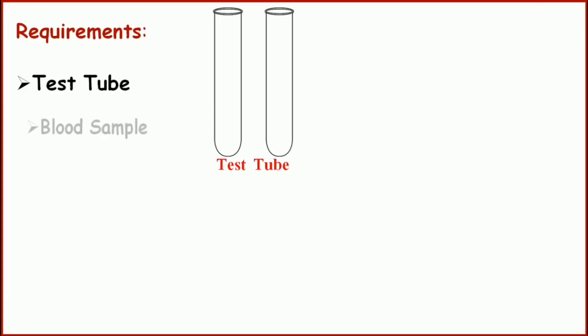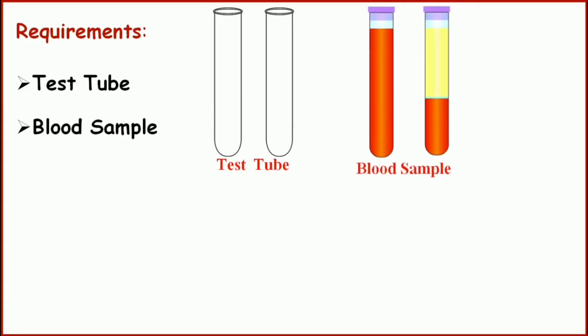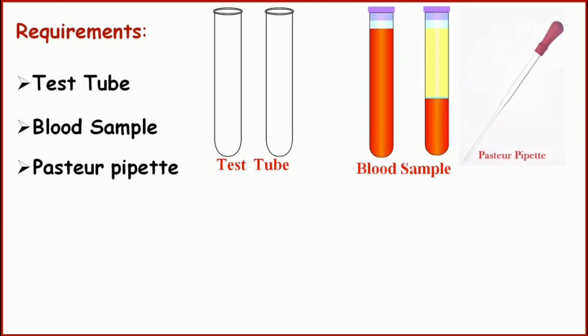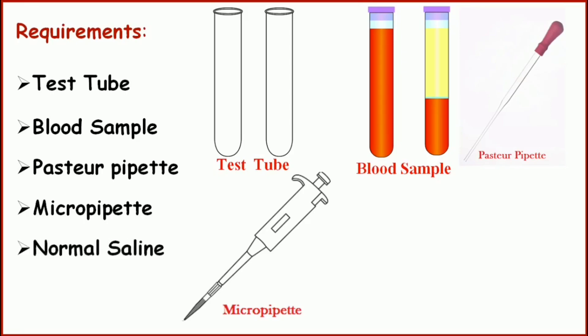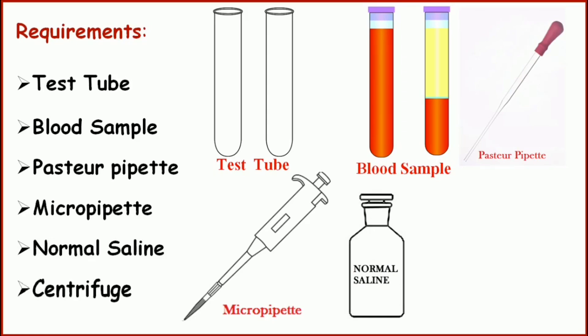So here in this video, I am going to explain how we are going to prepare 5% and 10% red cell suspension. Requirements for preparation are: we need 2 glass test tubes, then we need a blood sample — the blood sample should be an EDTA blood sample. Only the packed cell or the sedimented red cells are required for the test; whole blood is not required. Then a Pasteur pipet, a micropipet for measuring 50 microlitres of sedimented red cells, normal saline which will be mixed with the sedimented red cells, and finally a centrifuge machine to centrifuge the mixture of blood and normal saline.